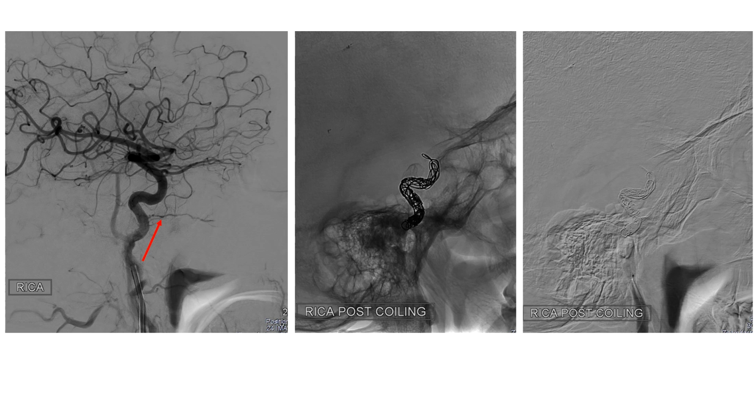this is an option, especially if there is very robust cross flow. Now, in most situations, the surgeons are happy to leave these tumors in there, and there are other options, including medications and stereotactic radiotherapy to take care of the intracranial component. However, in this case, it was thought that the tumor can be completely excised, and considering that there was good cross flow, we will do a parent vessel sacrifice of the internal carotid as well.